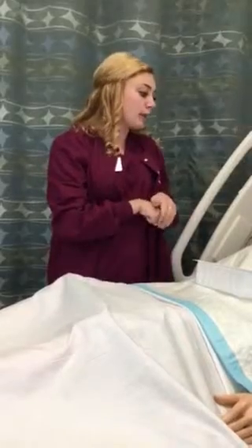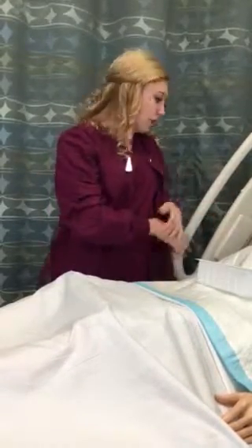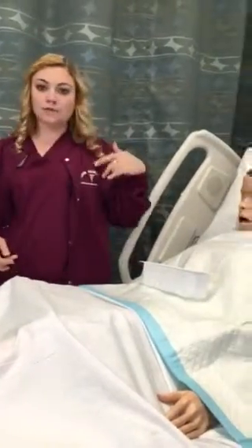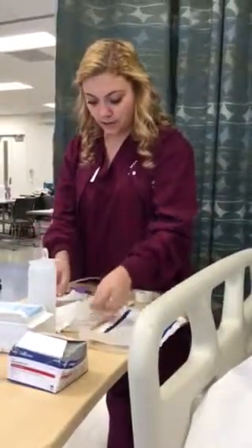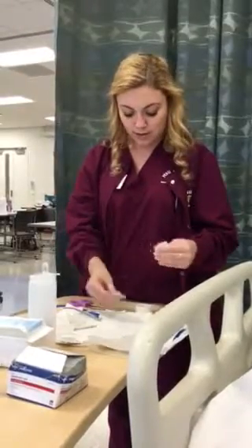We're going to leave the tubing in place just so we don't have to redo it again and put you through that again. Okay? So then I'm going to set them up in high Fowler's position. I'm going to prepare all of my stuff over here. So I'm going to put lubricating jelly on here so it's ready. Go ahead and untape.